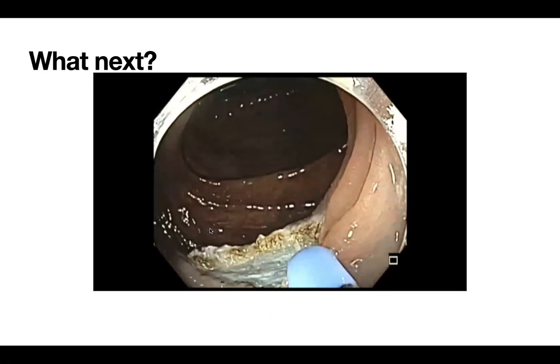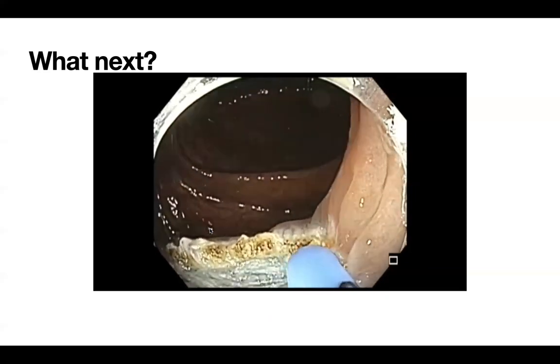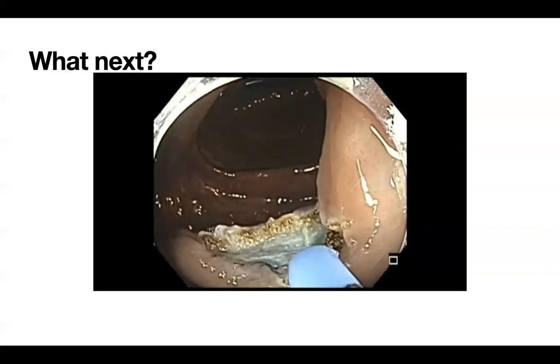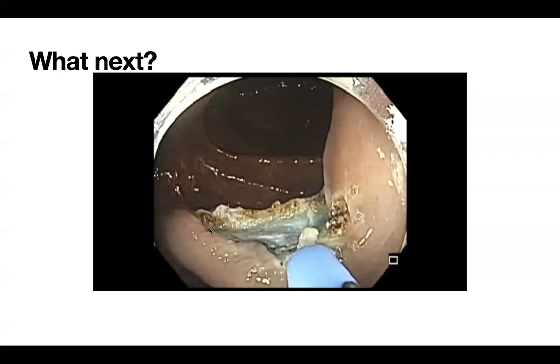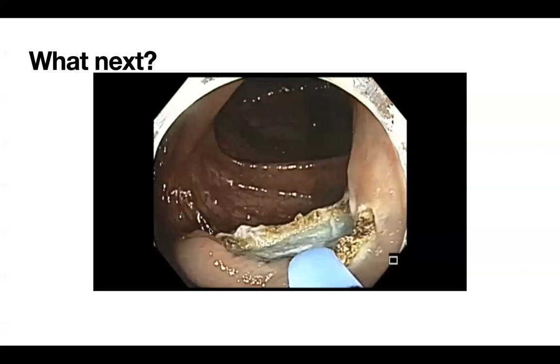If you're one of those who don't believe in the benefits of clips or are worried about the cost of clips, and you say, hey, which ones can I get away with not putting clips on? That is when you see a nice superficial submucosa.